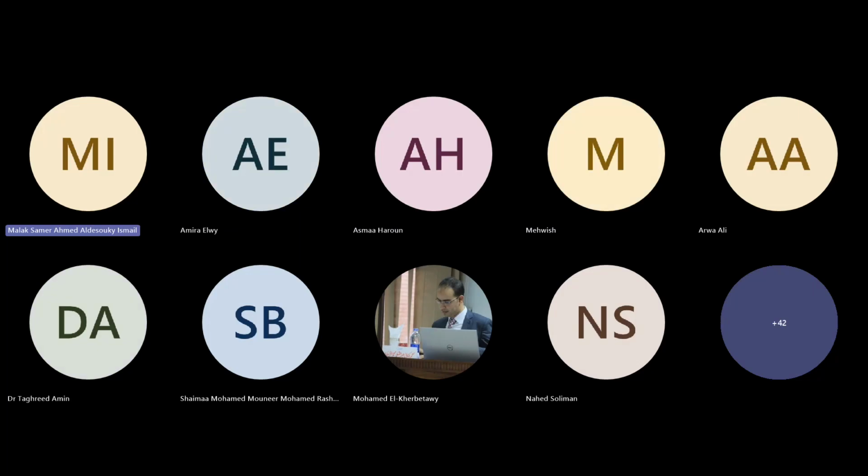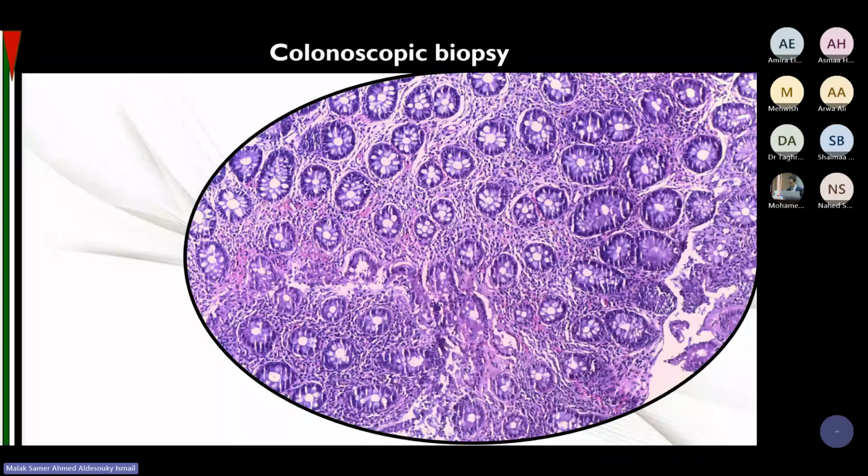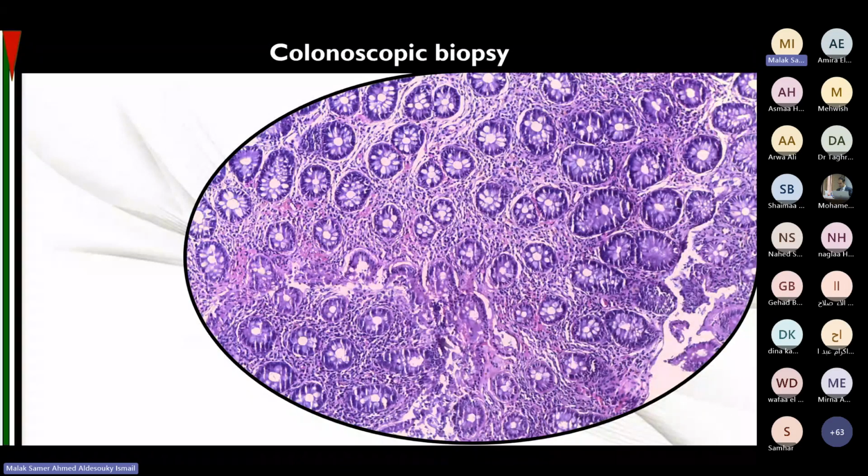Look at the pathology findings. First, we have our colon biopsy, and this is a low-power picture showing well-oriented colonic crypts with preserved mucin and lamina propria expansion, apparently by inflammatory infiltrate, and no erosions seen.